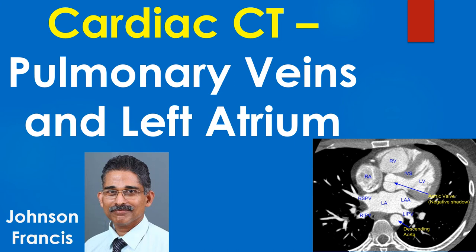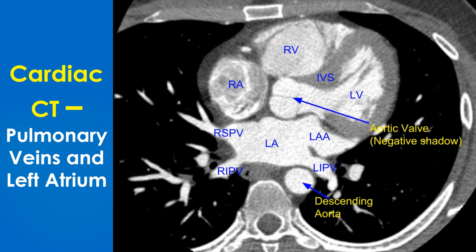This cardiac CT scan is shown at the level where pulmonary veins join the left atrium, displaying all four cardiac chambers and the left atrial appendage. Structures labeled include: RSPV – Right superior pulmonary vein, LA – Left atrium, LAA – Left atrial appendage, RI-PV – Right inferior pulmonary vein, LI-PV – Left inferior pulmonary vein, RA – Right atrium, RV – Right ventricle, LV – Left ventricle, and IVS – Interventricular septum.